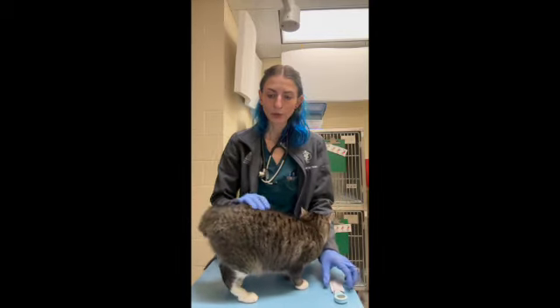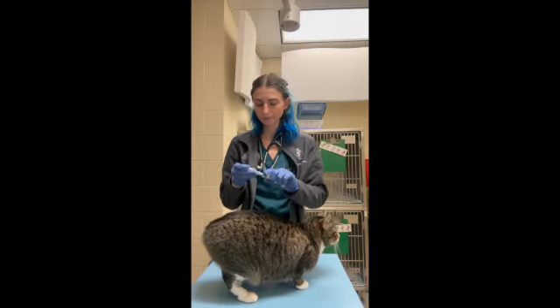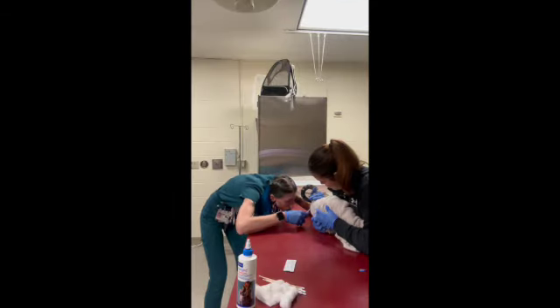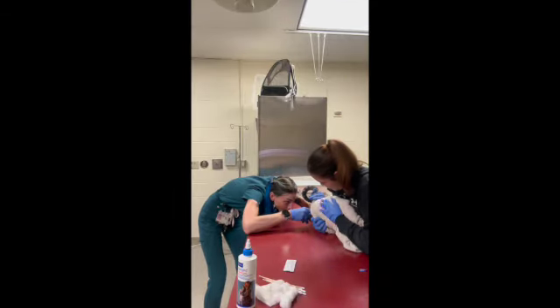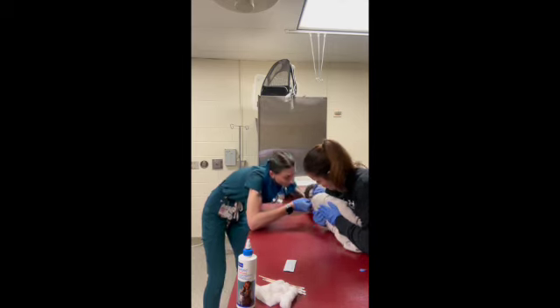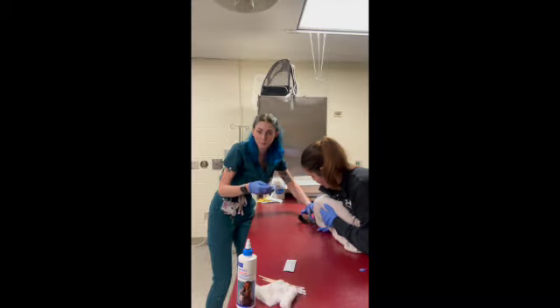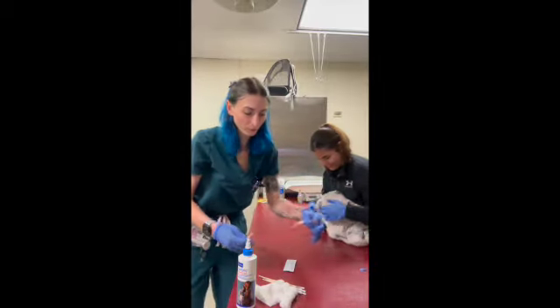So now we're gonna go ahead and just obtain our temperature. Oh, I know. I know. We're doing a great job. Good girl. All right, temperature was 100.8, so normal.